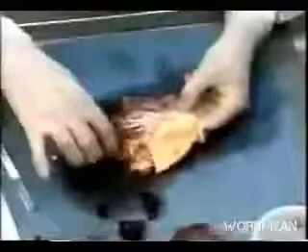Representative samples of the various tissues that are examined will be saved in formaldehyde, and so that's what you're seeing her do right now. The outflow tract to the pulmonary artery is normal, and the 3 leaflets of the pulmonary valve are intact and normal. This is the aorta she's opened, the aortic valve, and you can see the 2 coronary ostia where the coronary arteries come off from the aorta, just above the valve cusps.